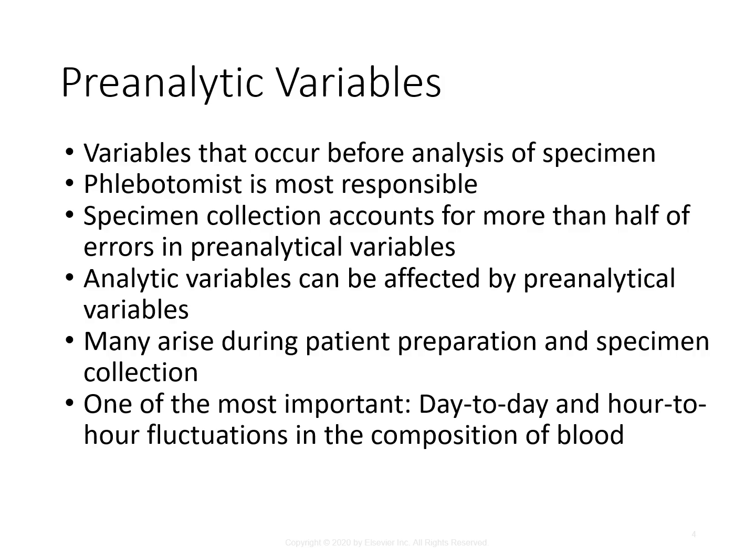Analytical variables, like I mentioned, are when the testing is actually performed, and that can be affected by the pre-analytical variables. Many of the pre-analytical issues will arise during patient preparation and specimen collection. One of the most important day-to-day and hour-to-hour fluctuations is the composition of blood.